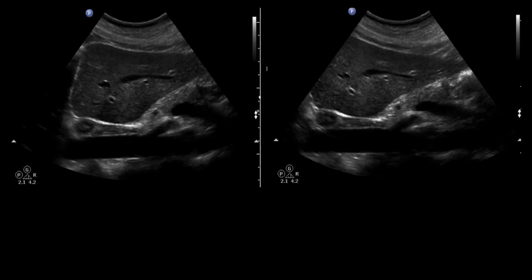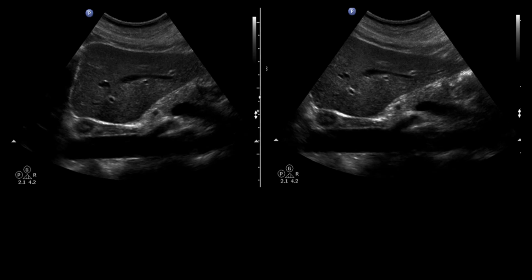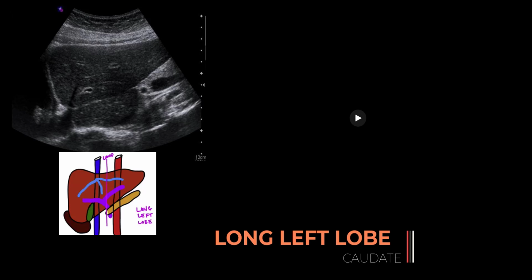As mentioned earlier, again, we can show the superior portion of the liver, showing the diaphragm and the heart on the superior side, showing that we also then need that second image by simply sliding down the patient's body inferiorly towards their feet, staying in the aorta plane to show that inferior tip. Moving then to the patient's right, we are going to stop now at the caudate lobe.